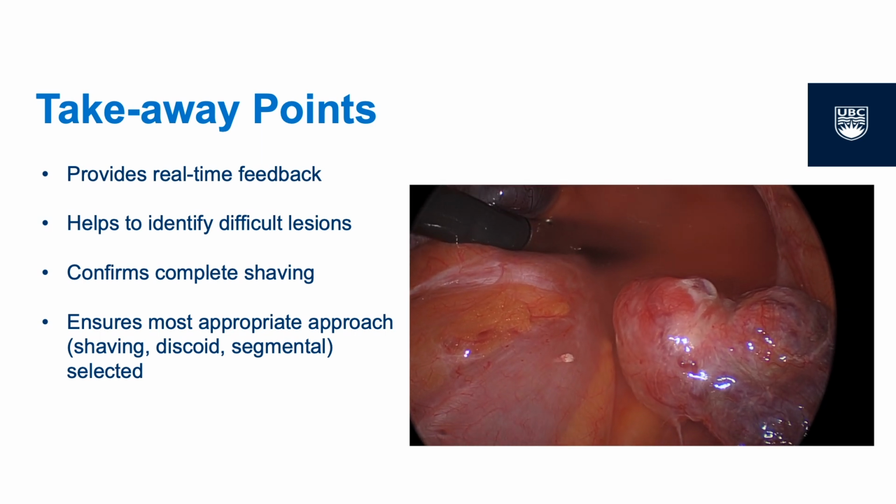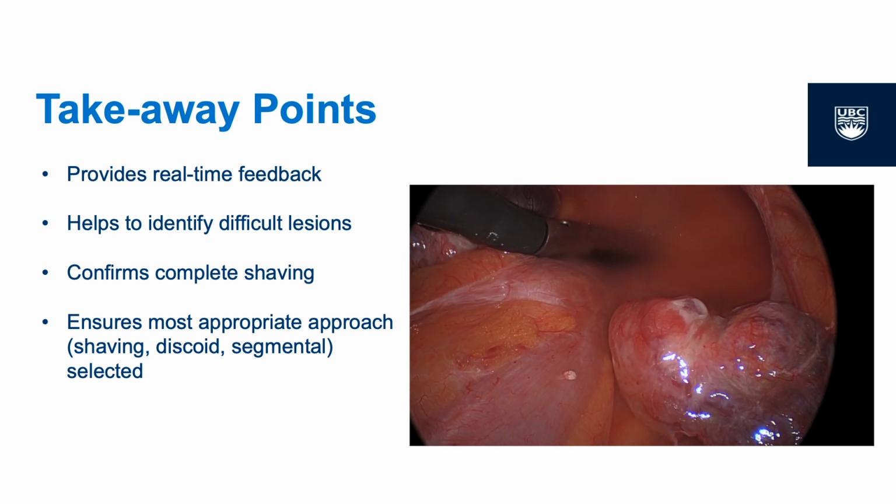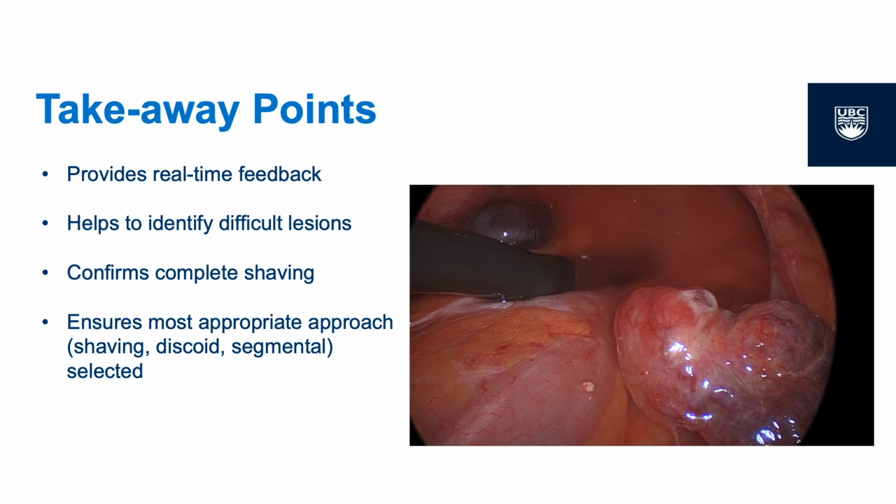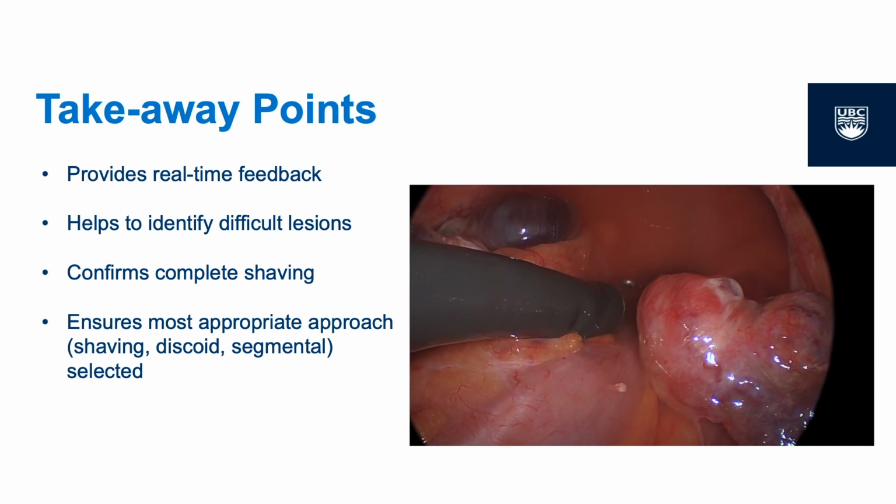It holds potential to ensure that when shaving is selected, the entire lesion is appropriately removed. Such information can also help to ensure the most appropriate and conservative surgical option is selected.